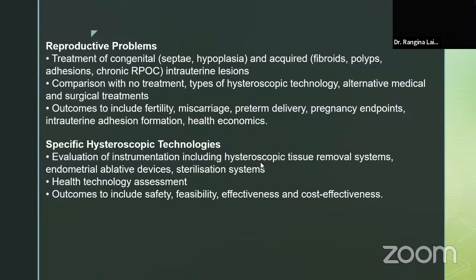And then we can see after putting the scope that there is a septum, we repair it, the patient gets pregnant, the patient delivers a healthy child. So it is very important for us, even in reproductive problems. And yes, it does have a very good outcome in fertility, miscarriage, preterm delivery, and intrauterine adhesions.